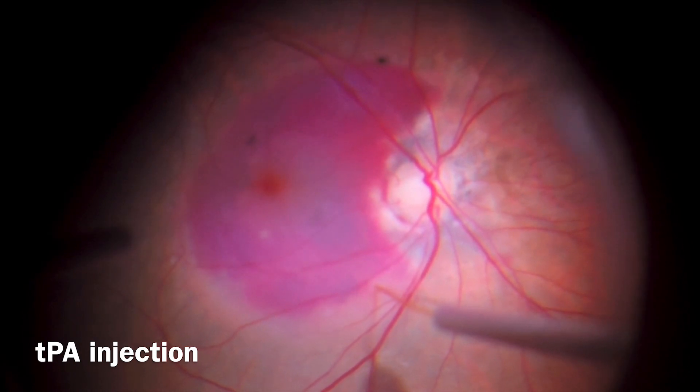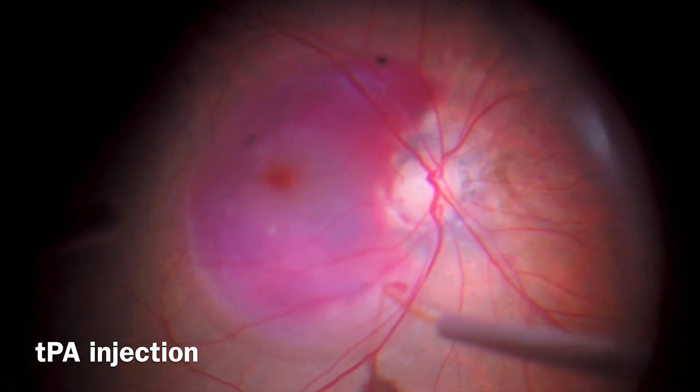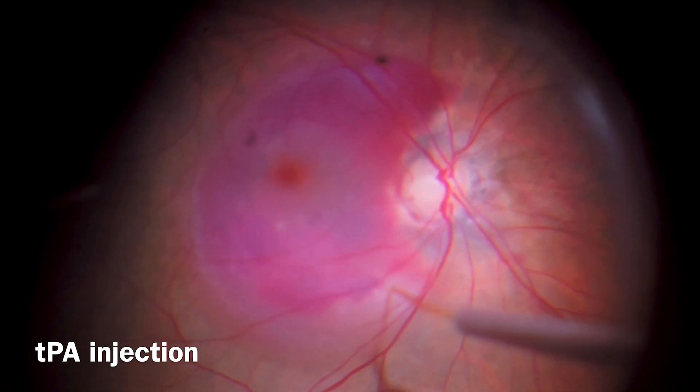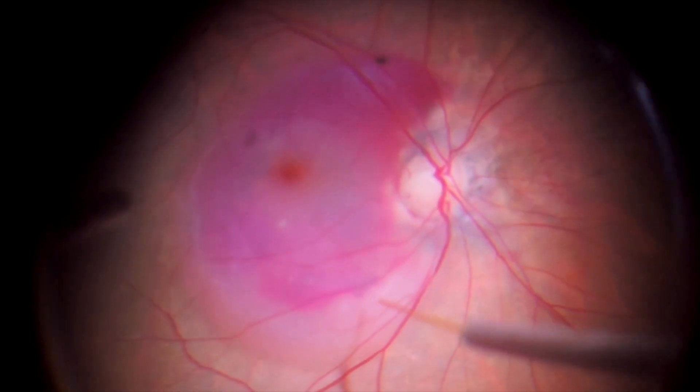The system allows a slower and semi-automated controlled mechanism with marked stability that can reduce the risk of complications like hemorrhage and macular hole formation, comparing with manual injection techniques.